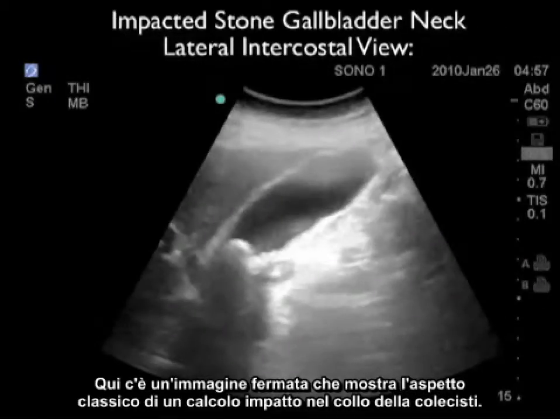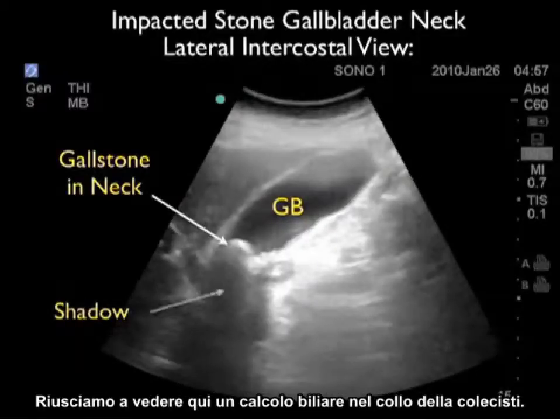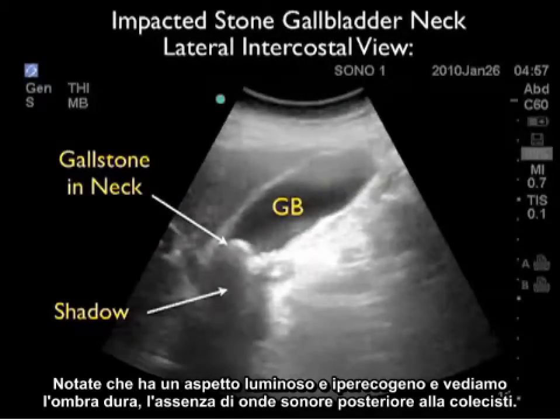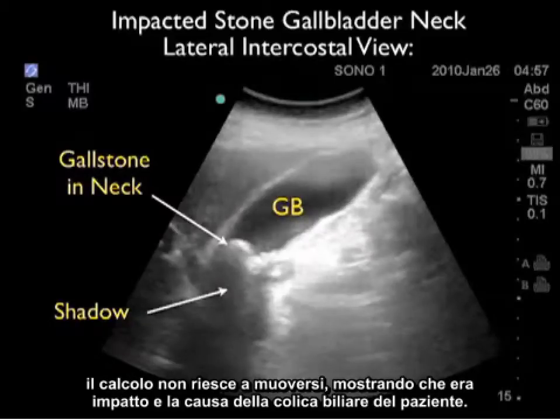Here's a still image showing the classic appearance of an impacted stone at the gallbladder neck. Looking through the lateral intercostal view, we get a nice long axis view of the gallbladder, with a gallstone located within the neck showing the classic bright or hyperechoic appearance and a hard posterior shadow — a blackout of sound waves. Interestingly, as we rolled the patient around, the gallstone failed to move, confirming it was impacted and the cause of the patient's biliary colic.